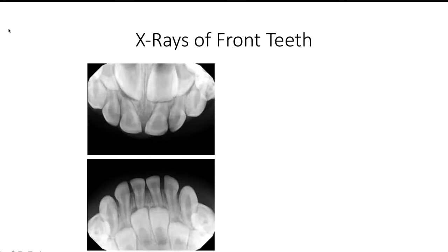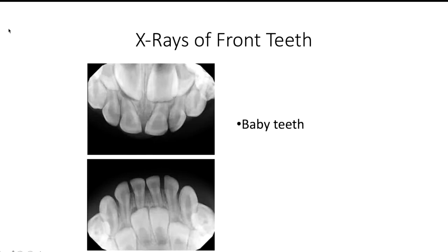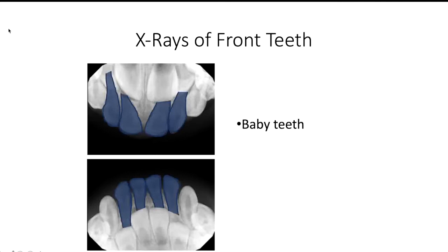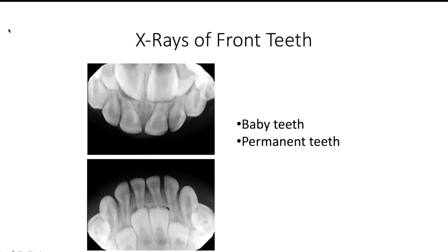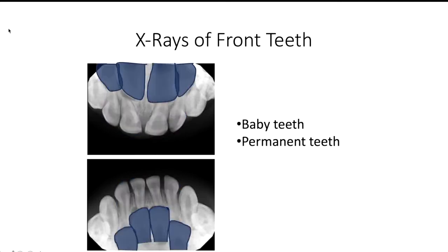Here is what these front teeth x-rays look like. You can see the top jaw and the bottom jaw, you can see the baby teeth here, and you can see the permanent teeth that are developing in the bone beneath the baby teeth here.